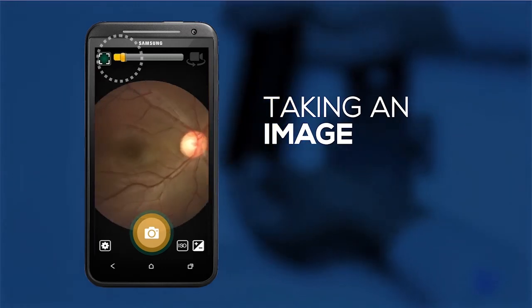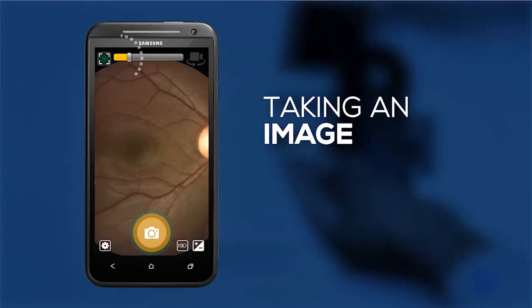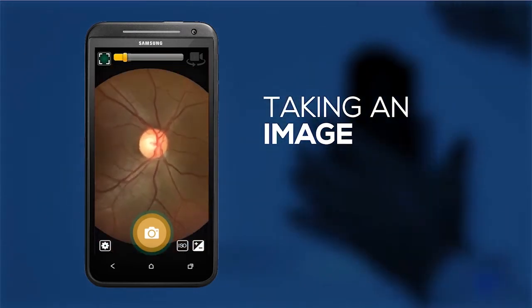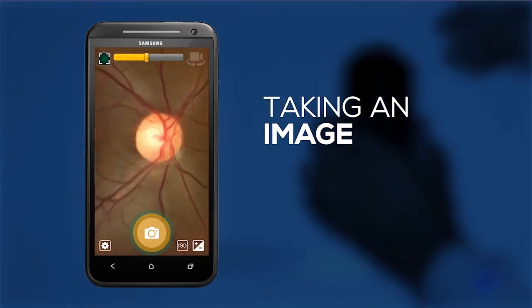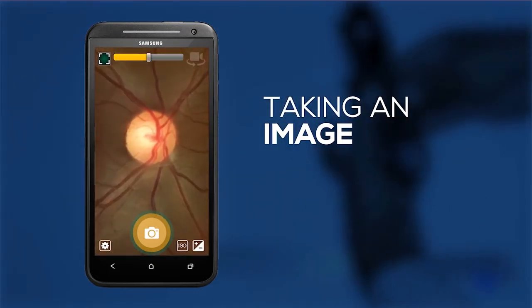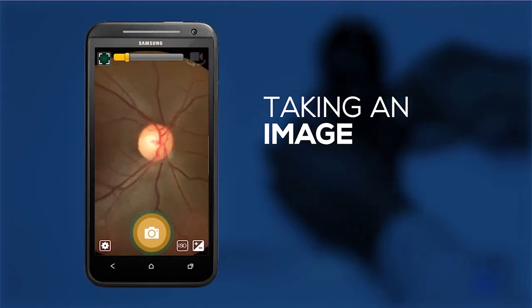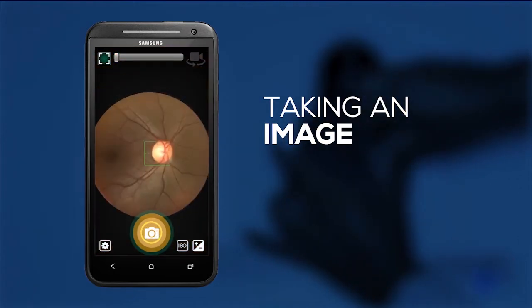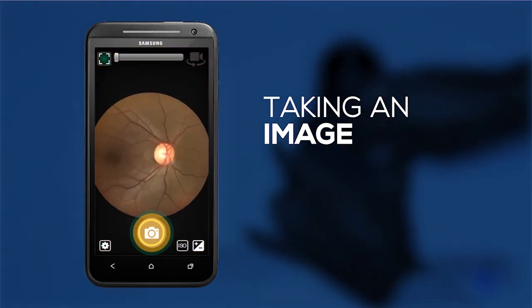Swipe the zoom bar to get the desired field of view. Touch to automatically focus and click to capture the image.